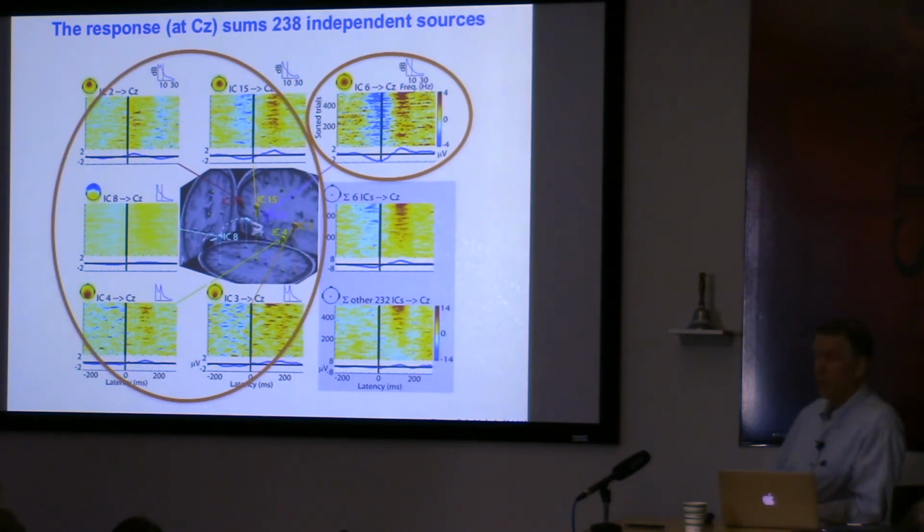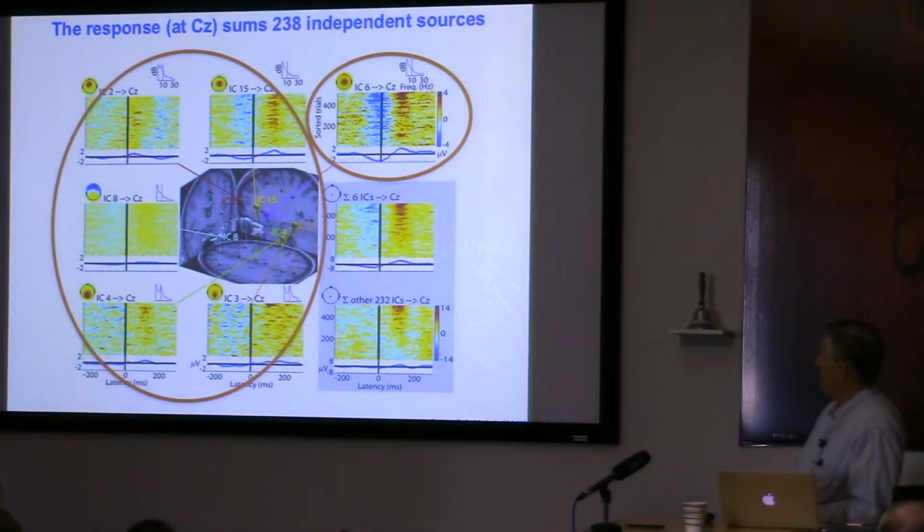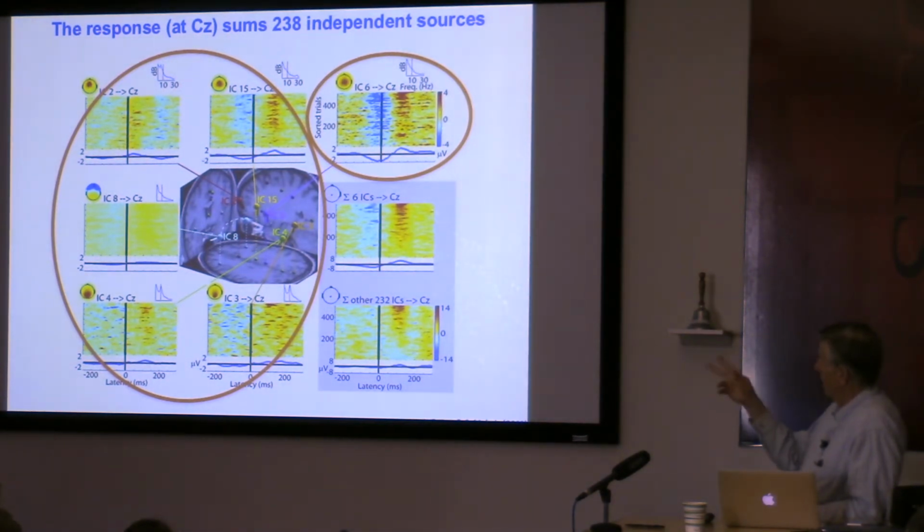But here are 5 more independent component processes that have been sorted in the same order, that have quite different projections. And you see that if you sort by the same order, you don't see the same kind of phenomenon, the same ratio, trial to trial in these other processes.